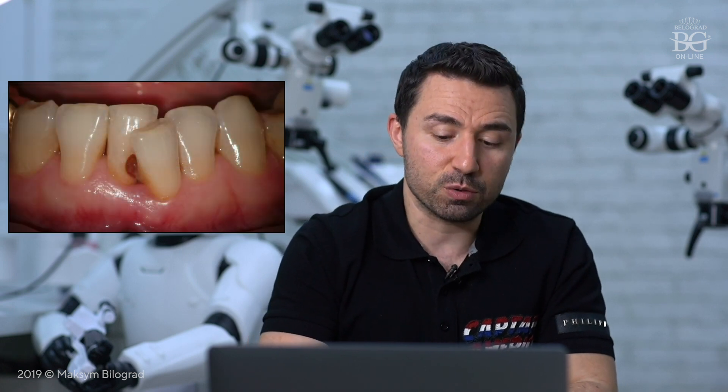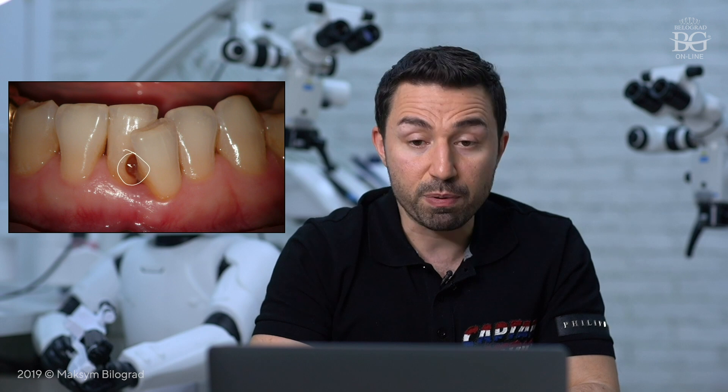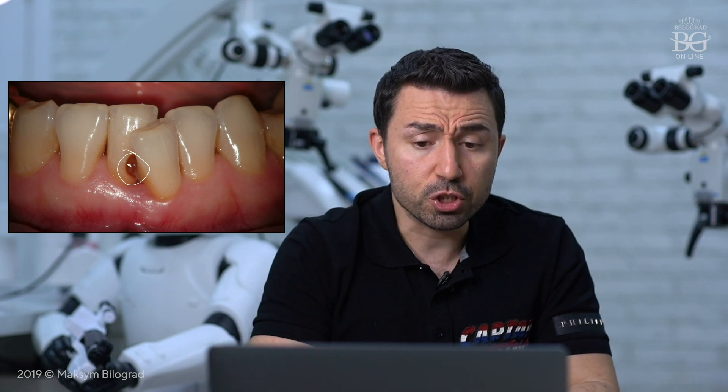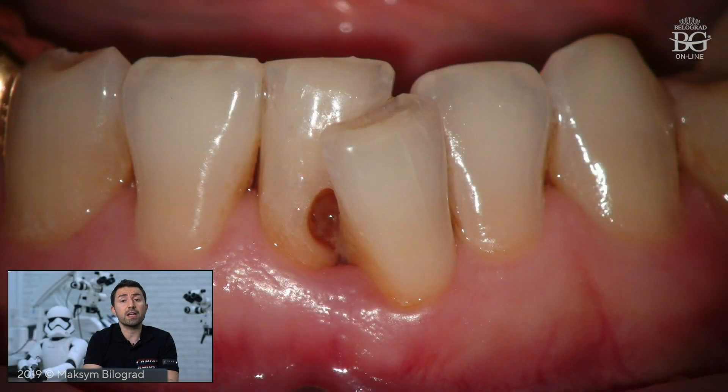This access is completely not a straight line and completely not according to the classical rules of endodontic treatment. This is the initial situation — this is the smile of our colleague. She came to my office and was very insistent on saving this tooth with no extraction and performing as minimally invasive treatment as possible. It was irreversible pulpitis with a big caries defect and a perforation into the pulp chamber. The localization of the caries defect was from the interdental and buccal side.